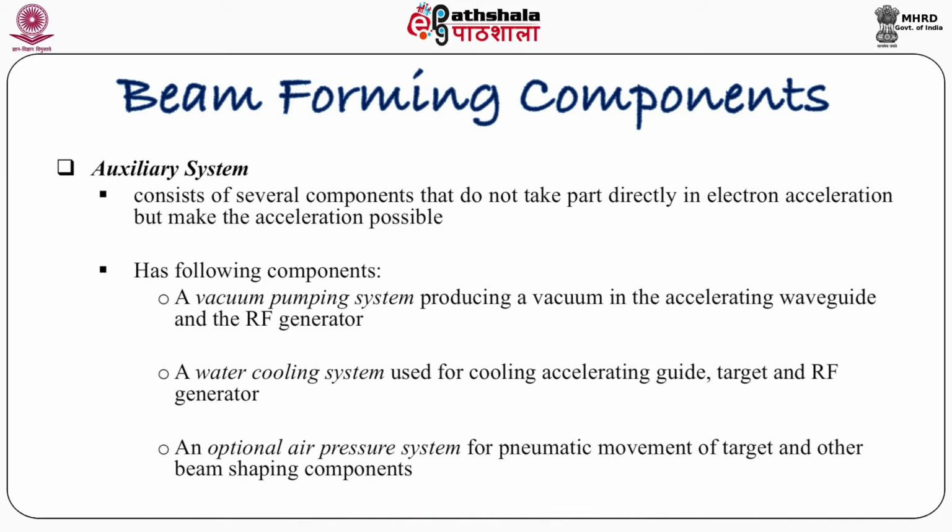An optional air pressure system for pneumatic movement of the target and other beam shaping components, because the target and the other components need to move. Hence, a pneumatic system is required in this auxiliary system.